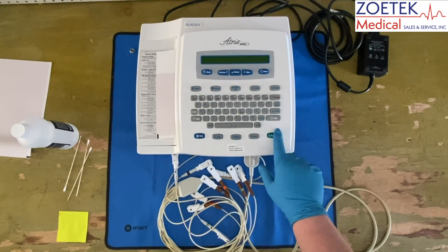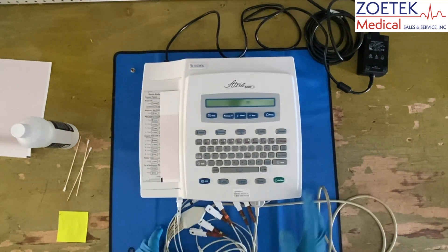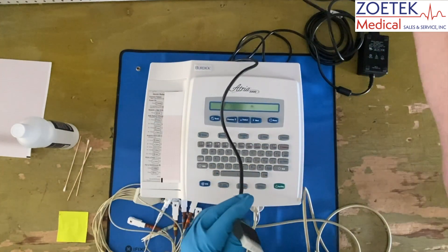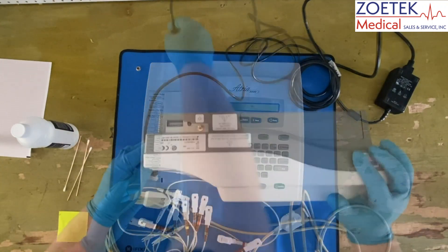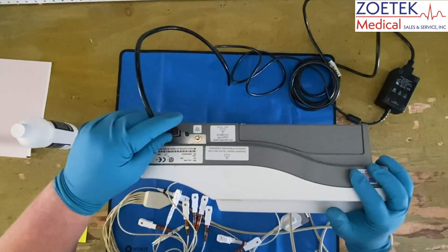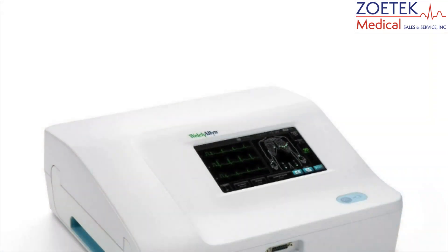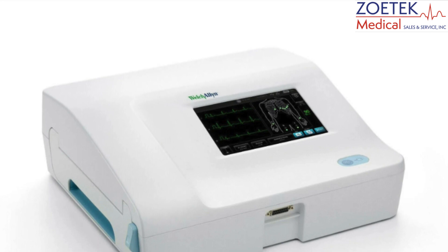If the EKG is not powering on, it is best to verify all of the connections on the power cord are tight and undamaged. Often there is an indicator on the device itself, or on the screen, to indicate the EKG is properly plugged in.